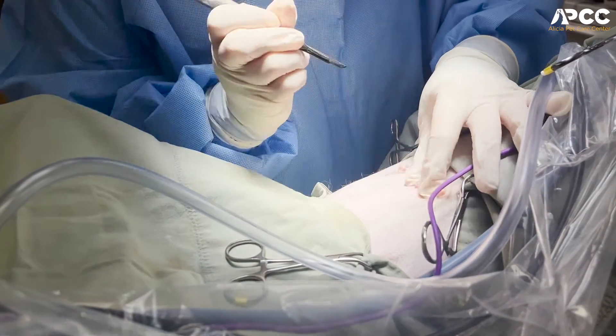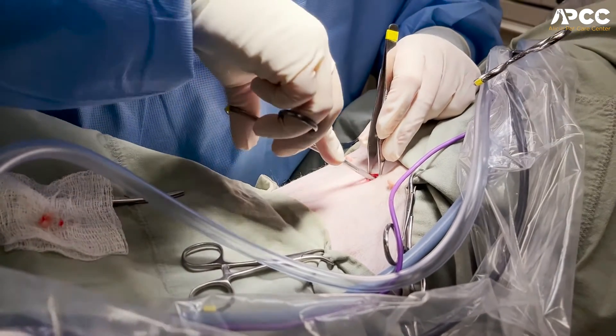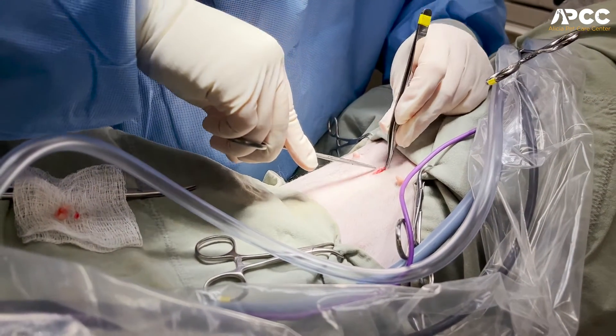The difference is we're going to be making a much smaller incision with a laparoscopic spay. We only need a centimeter. Just because we're cutting through less tissue, that is another reason why it's less painful with a laparoscope.